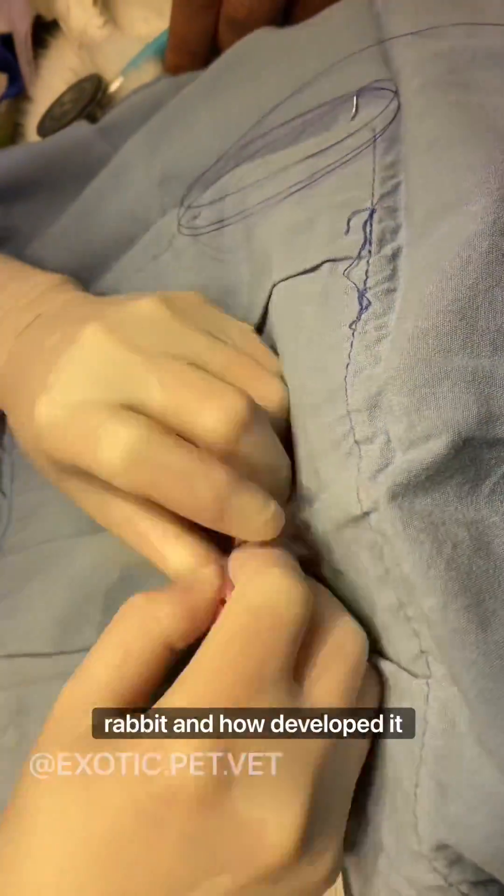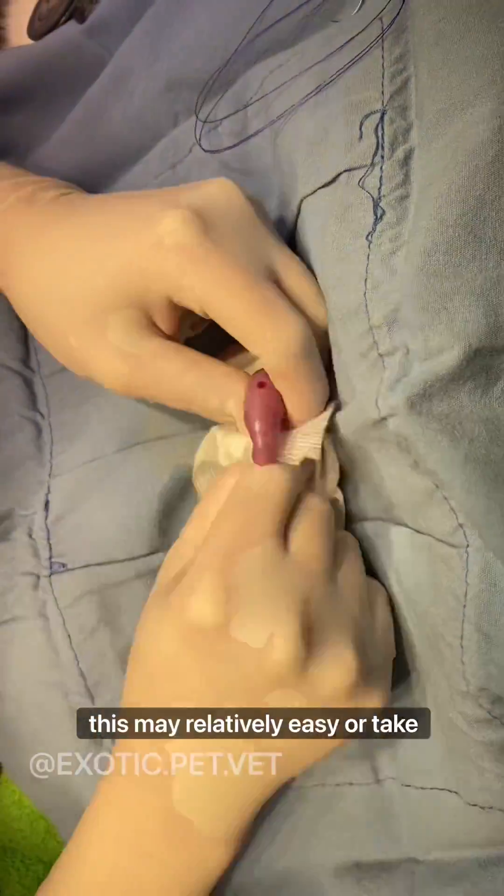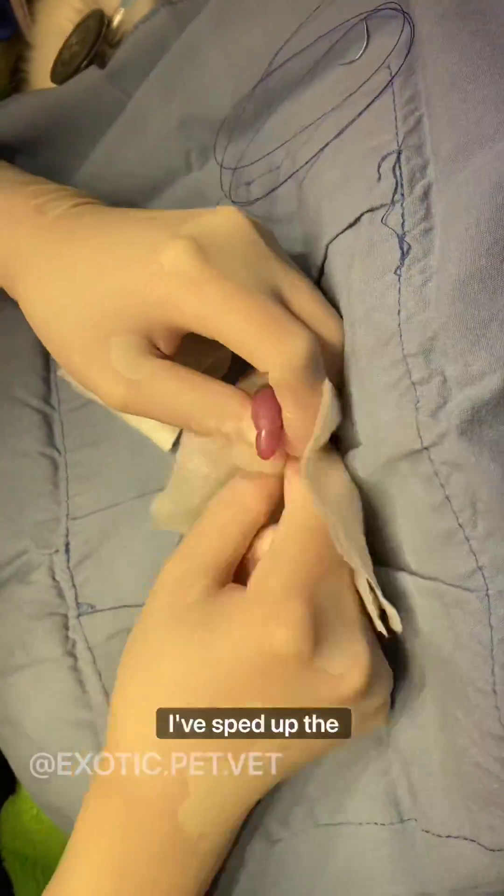Depending on the age of the rabbit and how developed it is, this may be relatively easy or takes some time. Here I've sped up the process.